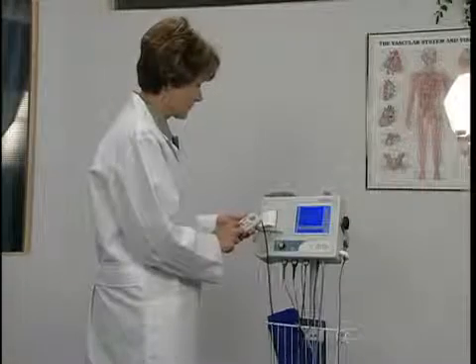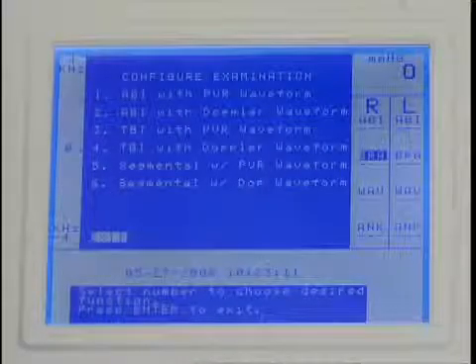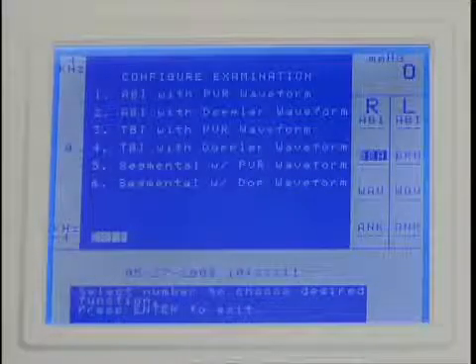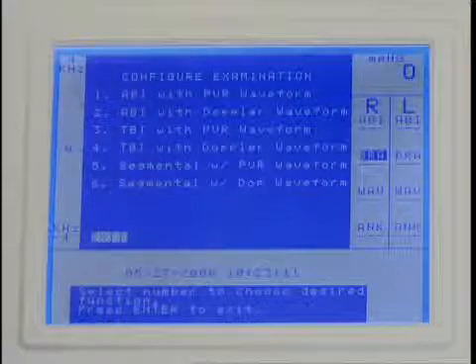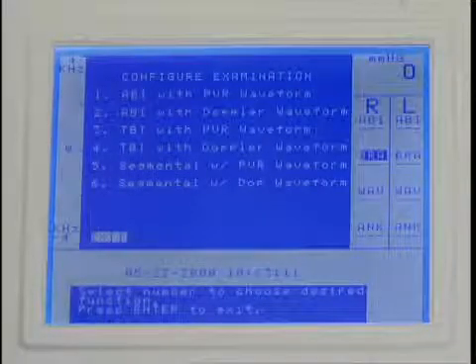For a specific exam requirement, press enter menu to open the options menu, and then press 1 to select configure examination. There are six choices for performing an ABI, TBI, or segmental study using either Doppler or PVR to obtain wave forms.